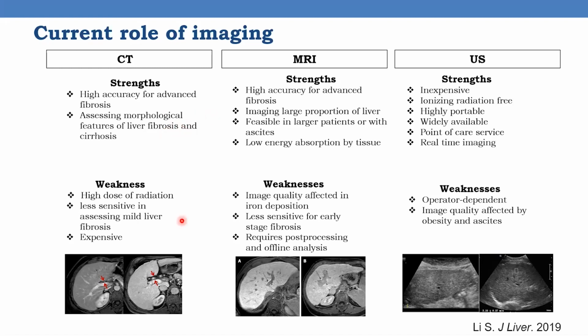However, both of them are limited by lower sensitivity in assessing mild liver fibrosis, and both are also limited by being expensive. Of course, CT scan has a high dose of radiation. MRI is limited by the fact that it requires post-processing.